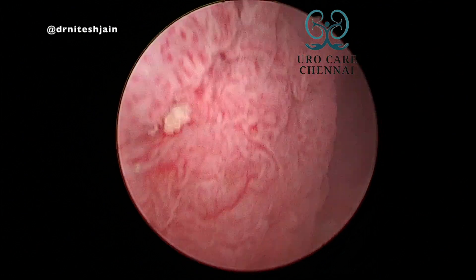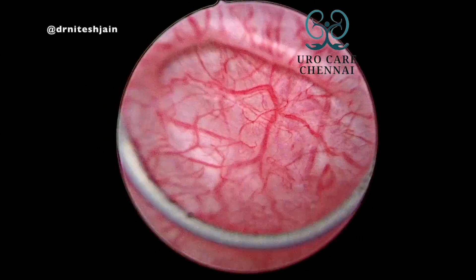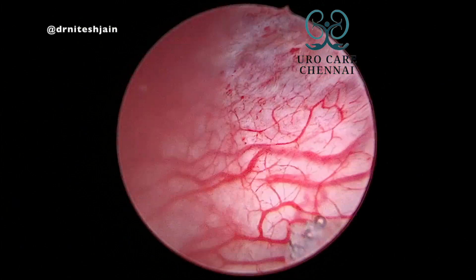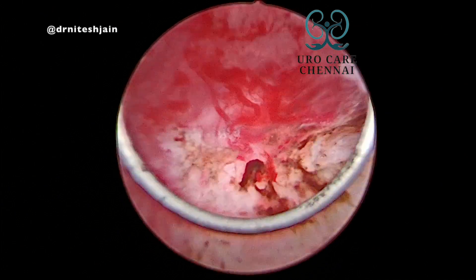You can see there is a lot of vascularity in and around the tumour. All this vascularity can initially be coagulated using the loop, so that the vascularity of the tumour decreases.